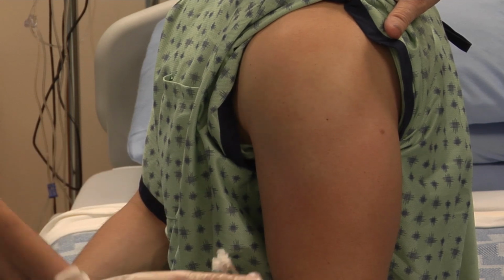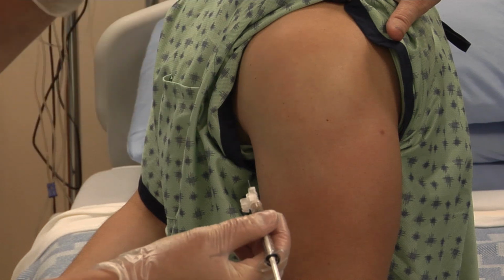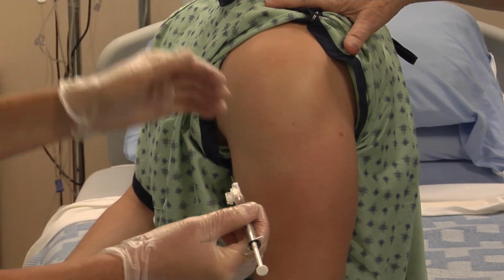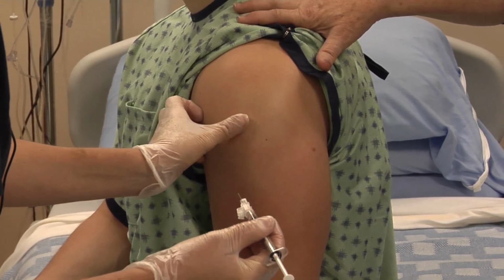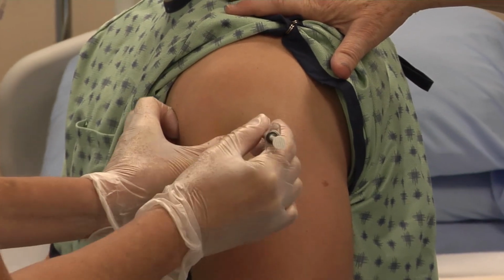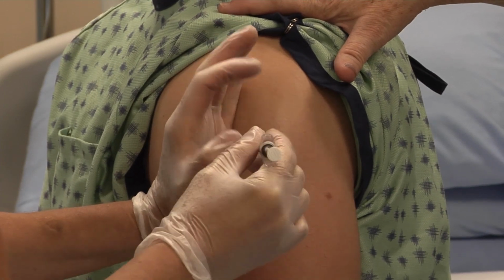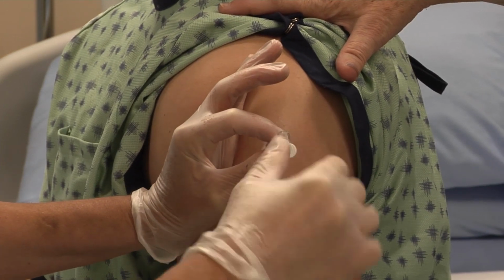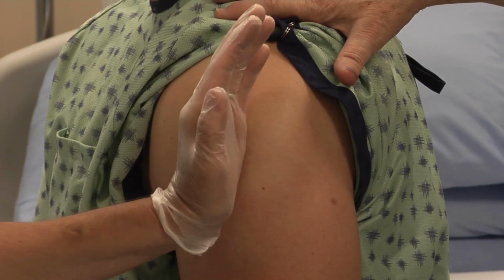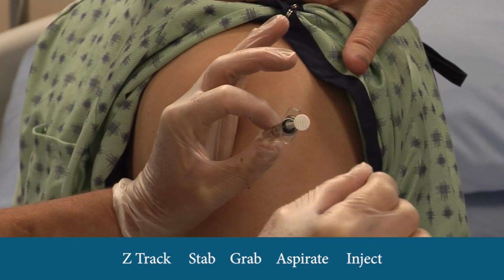Okay, so now we have to Z-Track. So Z-Track is a method of just trying to displace the top tissue layers so that the medication's not going to leak out afterwards. And it's really pretty straightforward. You just have to slightly move the skin. So Z-Track, stab, grab, aspirate, inject. Okay. So do that once more. Z-Track, stab, grab, aspirate, inject.